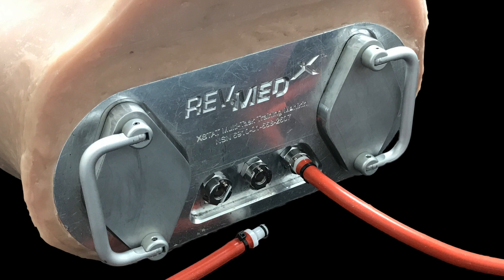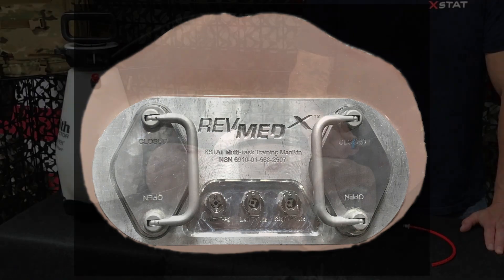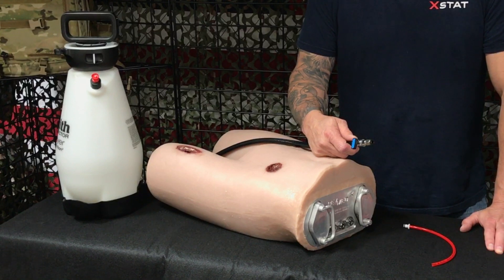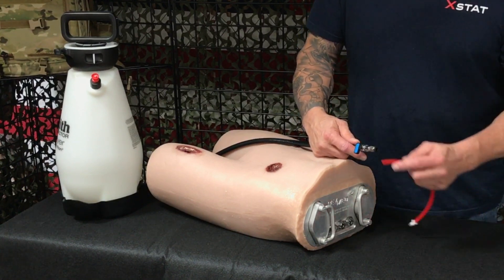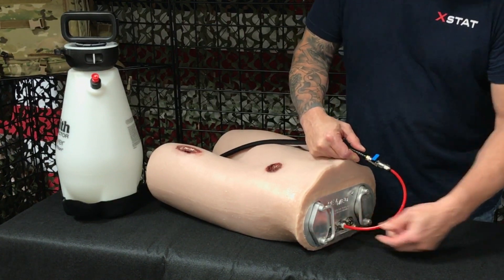Each connector is clearly marked showing which wounds they are associated with. There are several methods you can use to simulate bleeding. You can use a pressurized fluid tank that has been adapted for training mannequins. These three gallon tanks can provide continuous high flow arterial bleeding for several minutes.